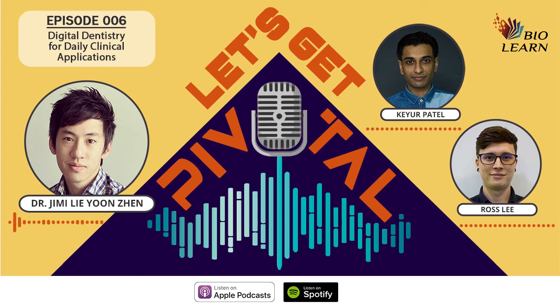So 3D printing is actually quite limited. I'm looking towards milling, hopefully. And 3D printing doesn't provide you too much, apart from possibly dentures as a final restoration. It's useful and helps you along the way, but it doesn't really give you much finality to a situation, other than dentures.